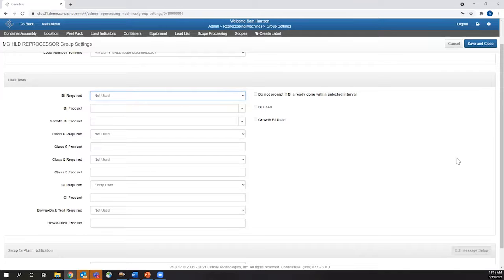So you then have to remember what that ATP readout was, or that pass or fail, or if you're not the one who's going to take that scope out and document it, then how is that getting relayed? Because you're not going to have the screen to document that ATP or a residue test, pass or fail. You won't have that screen until you've created the load.